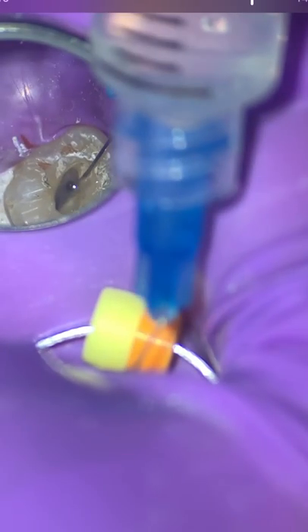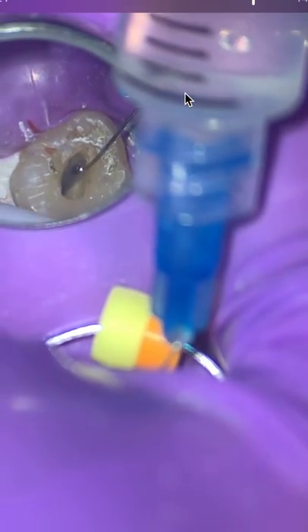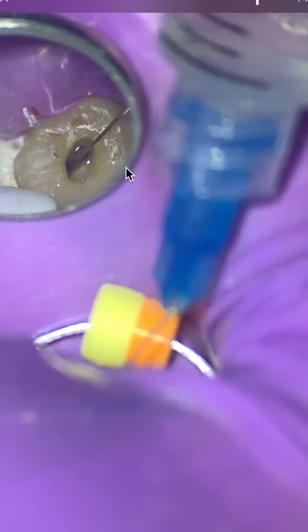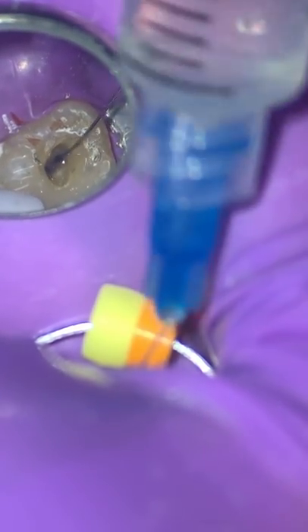So while I'm talking here, we're going to irrigate it out. You can see there's lots of irrigant. I'm using a 10 mil syringe. We've got lots of irrigation. That's a key. Lots and lots and lots. And you can see it's coming out clean. We're making sure we get rid of that BC sealer. Is it critical? Not really, because it's going to be part of the process anyways. But I want to make sure I get rid of everything, debris, anything, pulpal tissue, if there's any tissue left in the corona.